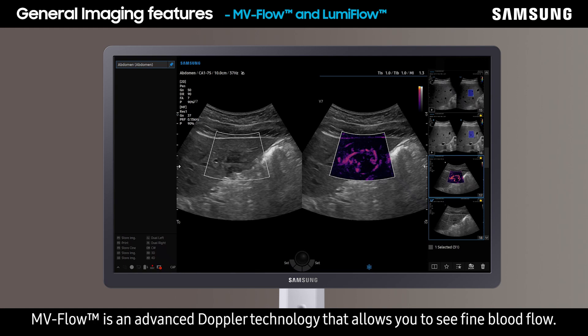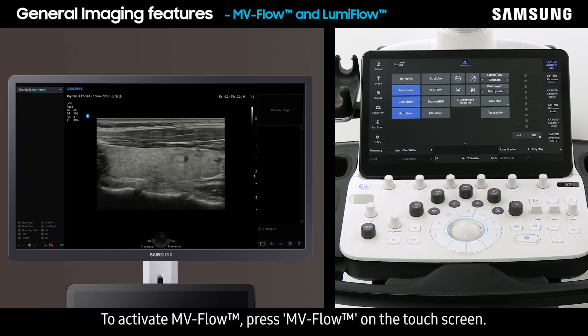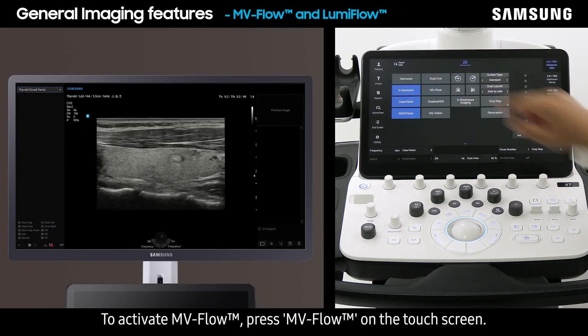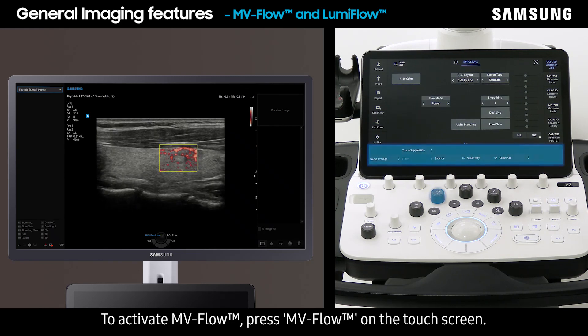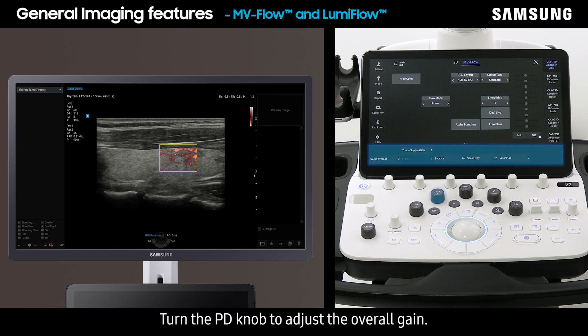EnvyFlow is an advanced Doppler technology that allows you to see fine blood flow. It can be used with a technology called LumiFlow, which portrays blood vessels more three-dimensionally. To activate EnvyFlow, press it on the touch screen. Use tissue suppression and sensitivity to enhance the visualization of vascularization, and turn the PD knob to adjust the overall gain.